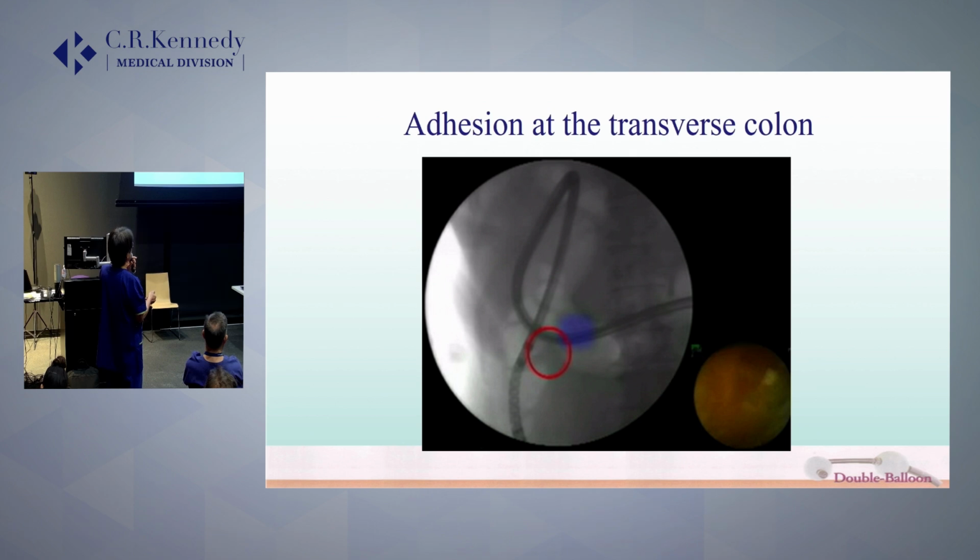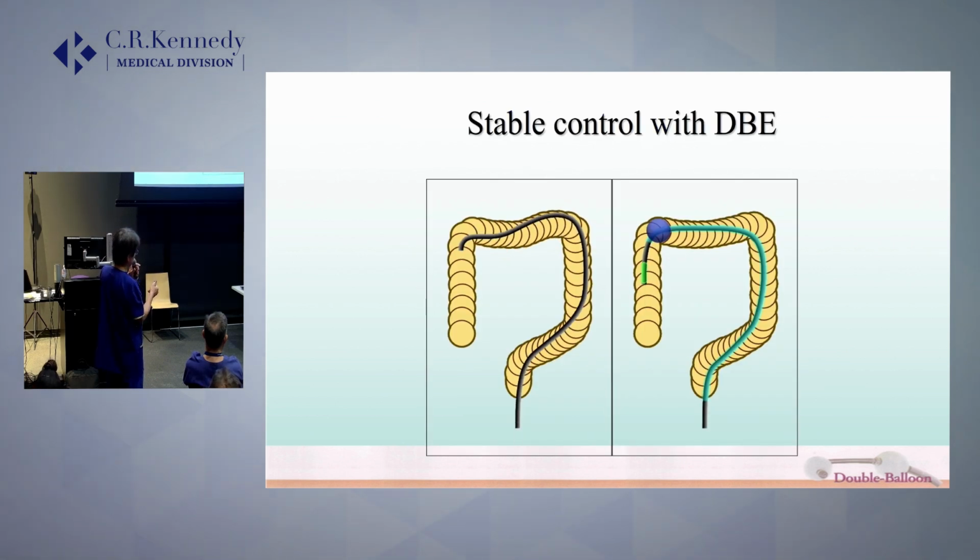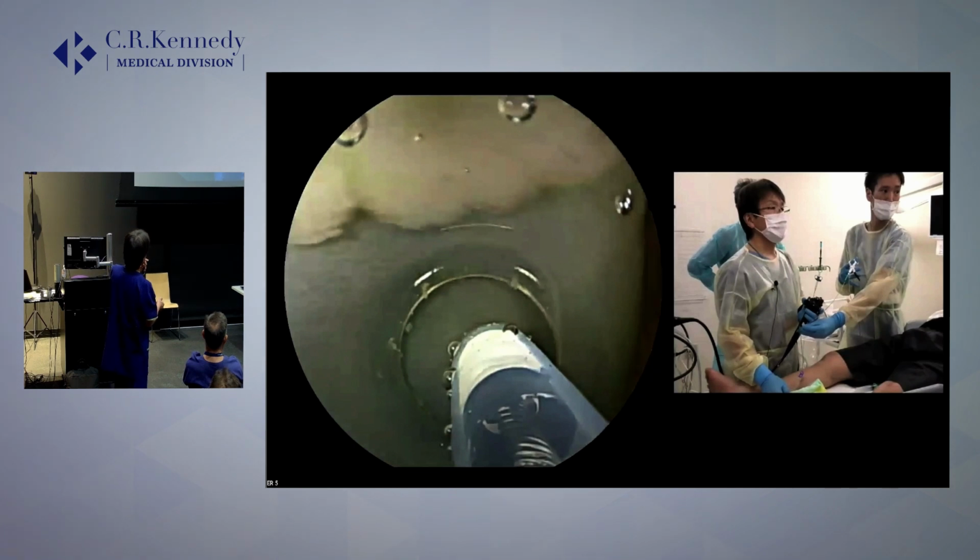But my main topic is stabilization with the double balloon endoscope. And then I want to show you this video. This is an ESD.